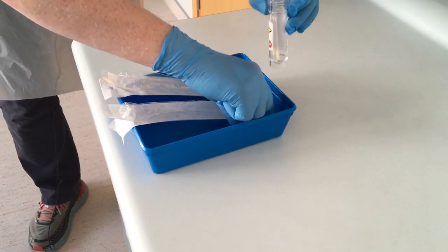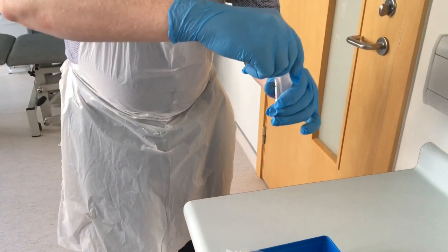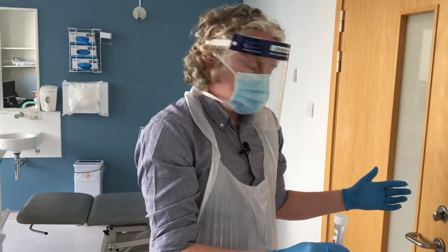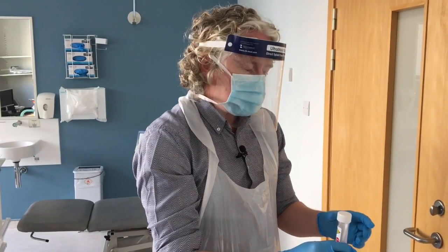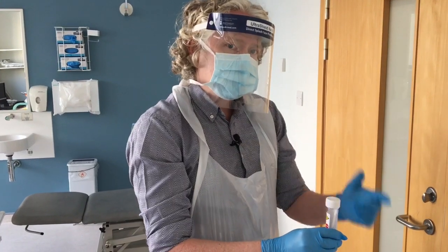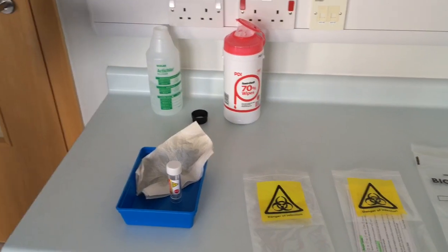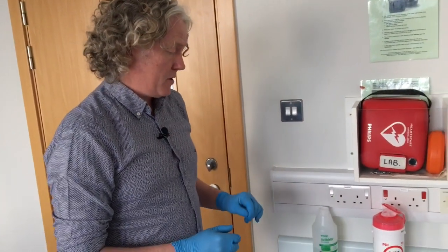We just bring the swab over, break it into the sample bottle, and pop the lid on. Now I'm going to pass the sample out the door to my colleague, who is going to do the next steps to prepare this sample so that it's safe to be transported to the laboratory.